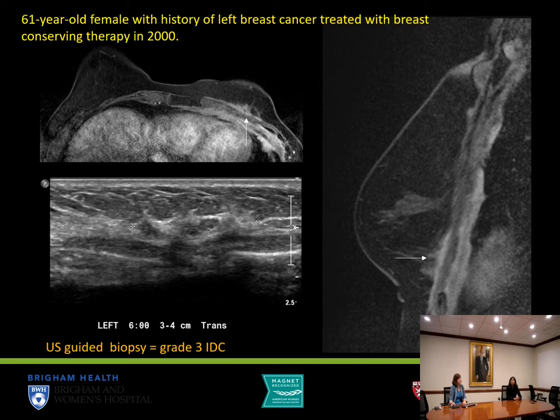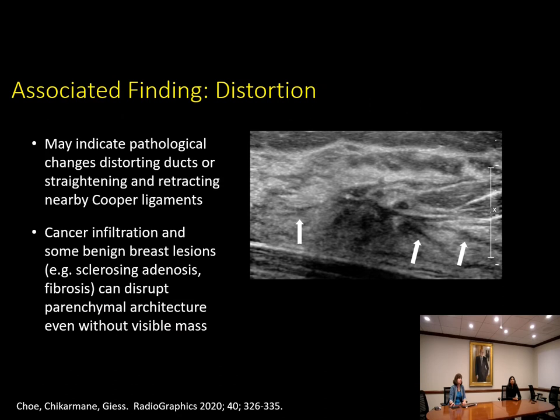This is a challenging lesion — if performing a screening study it might be hard to detect as a discrete finding, but it's much more evident when you know you're looking for a specific finding to correlate with MRI. Distortion as an associated finding is important to recognize sonographically, because it can indicate pathologic changes causing ductal distortion and straightening and retracting of nearby Cooper's ligaments. We worry most about cancer infiltration causing that distortion, but benign lesions including sclerosing adenosis and fibrosis can do it as well.